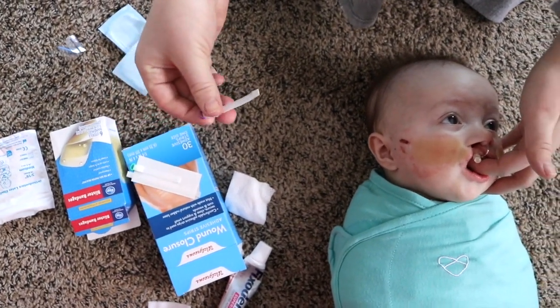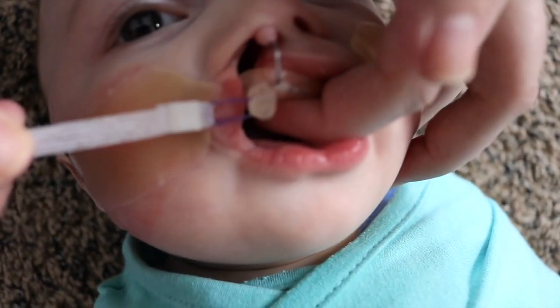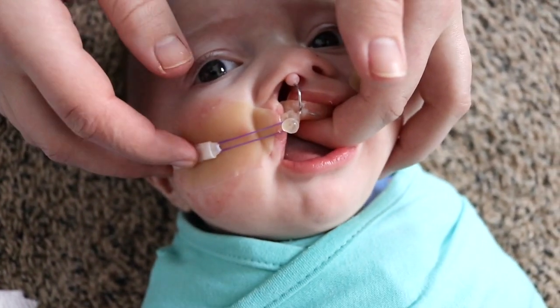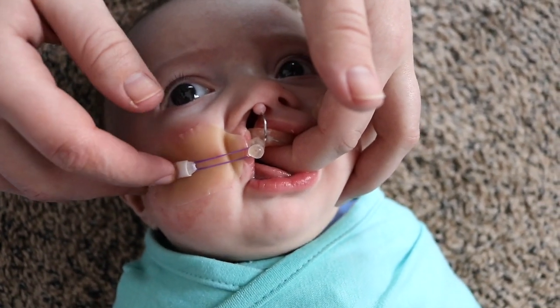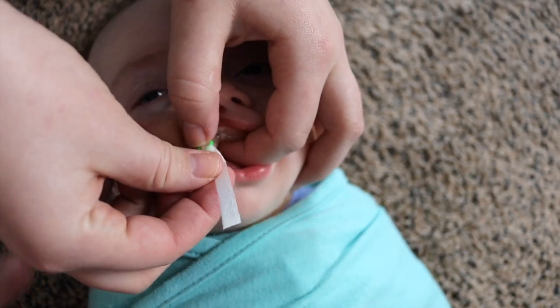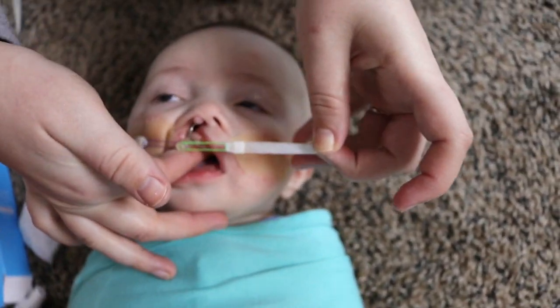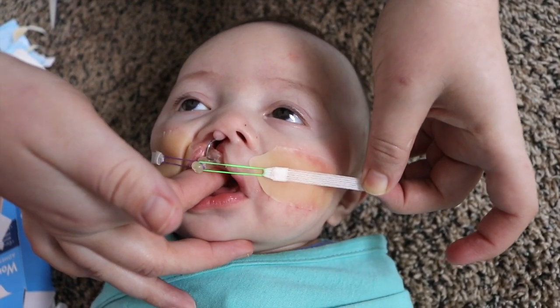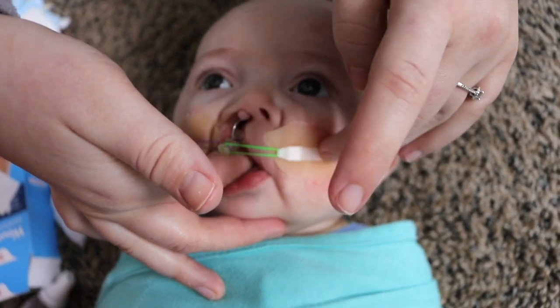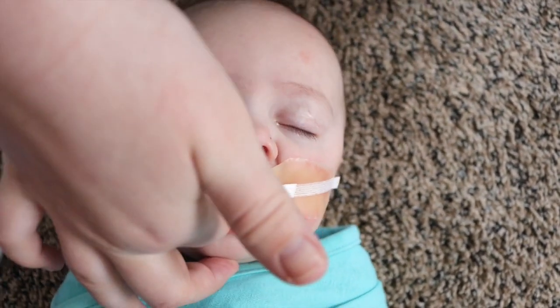Now that the NAM is secured, I take my first tape with the band attached and hook it over the knob, pulling out so there's a good amount of tension on it. I keep holding the NAM so it doesn't pop out while I apply the tension, then push down that tape until it's nice and secure. Then I take my second band, hook it around, and pull it the opposite way, trying to create an equal amount of tension. We're now putting equal tension on both sides to push the gum pads back with direct pressure.